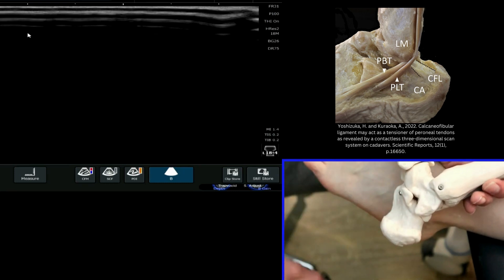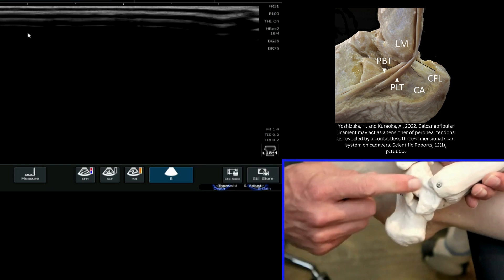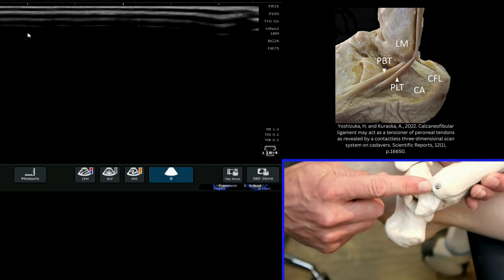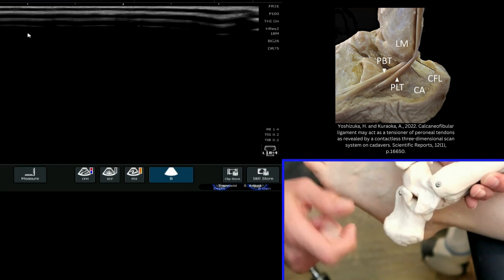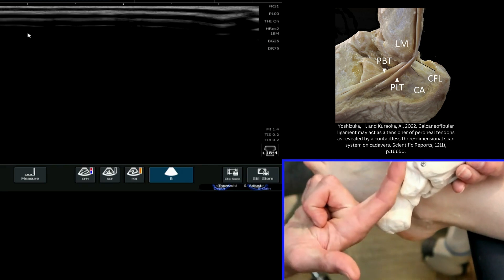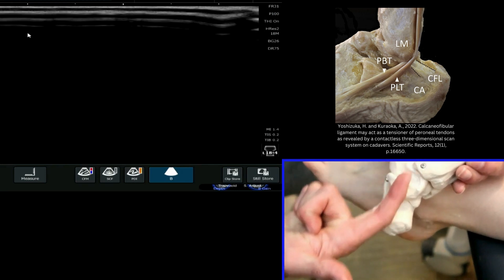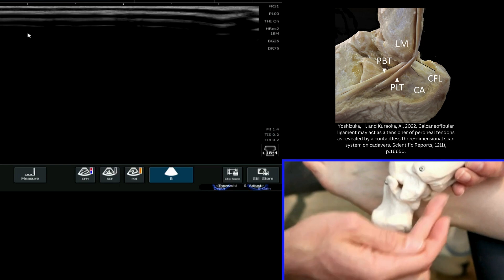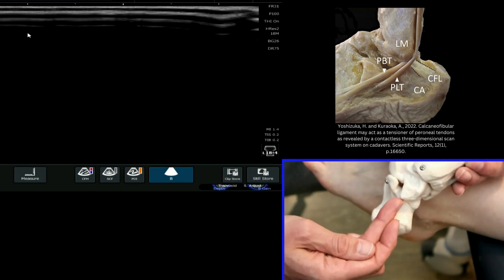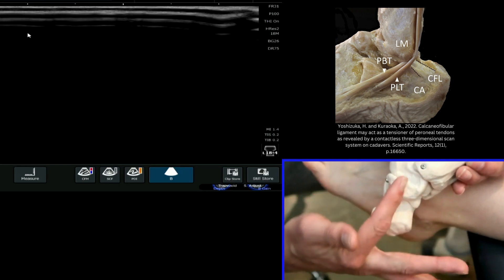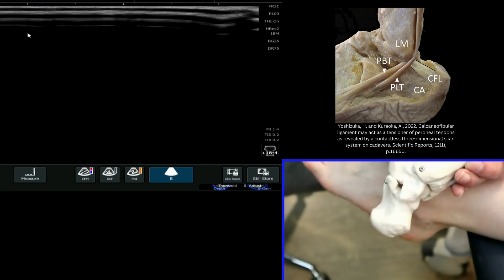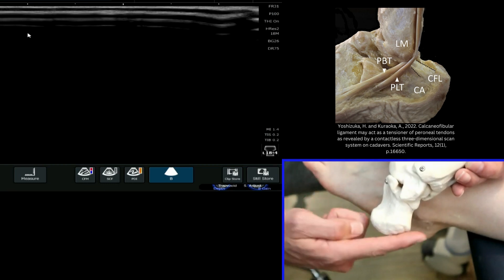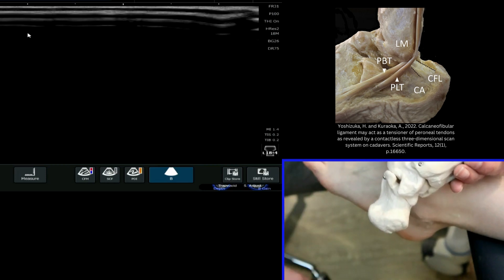With the calcaneo-fibular ligament, we know that it goes from the tip of the distal aspect of the fibula — the lateral malleolus — down towards the calcaneus, and it almost sits in a straight line at this point with the peroneal tendons coming round. We're looking at placing our probe in a line towards the apex of the calcaneus, or heel.